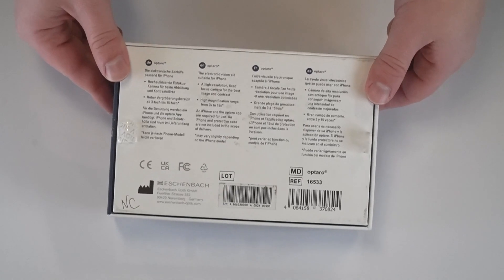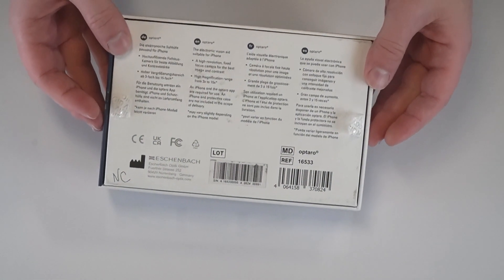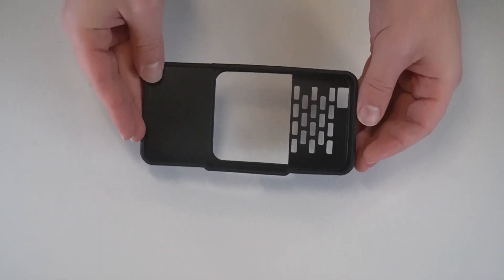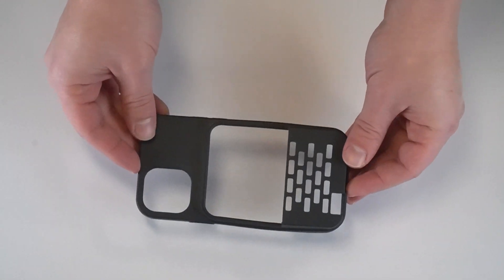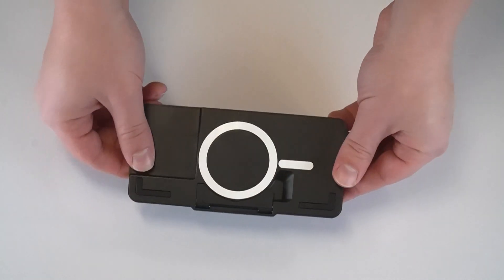The Optaro has a built-in camera and battery, and it provides the image that shows up on your iPhone screen. Number three, you need some kind of case. There are two options: you can get a specific case for your iPhone model, like a 12 Pro case, or if you're not sure what phone you have or plan to upgrade soon, you can get the universal case, which works with any iPhone 12 or up. The big difference is the universal case is not as secure as the model-specific case.